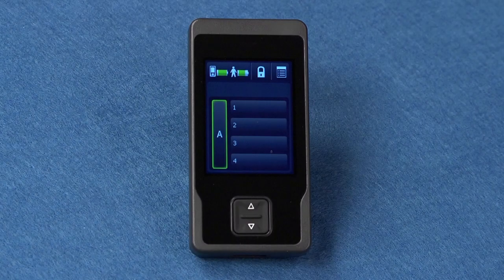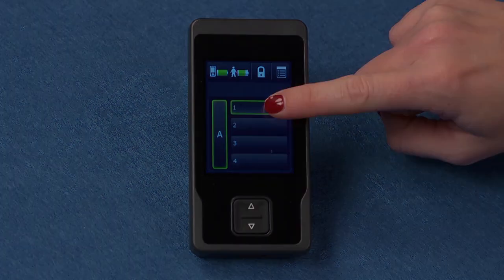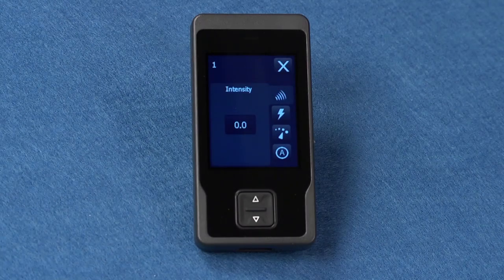Next, let's go to your program buttons. In each group, A, B, or C, up to four programs will be available, indicated by numbered boxes. After pressing any of the program buttons on the home screen, available settings for that program will appear.